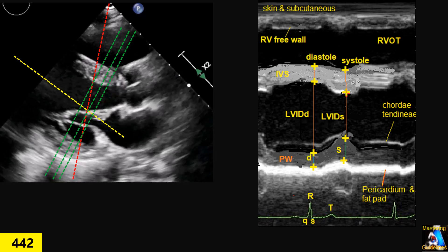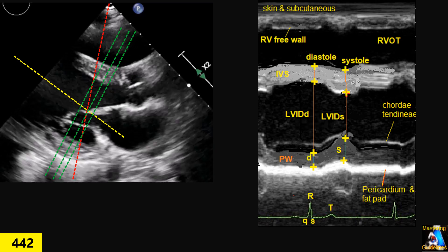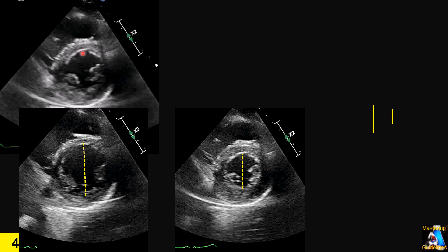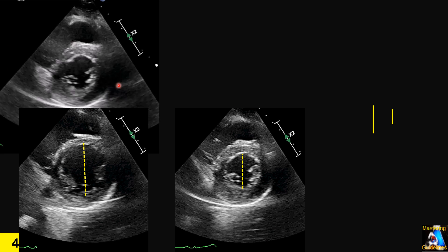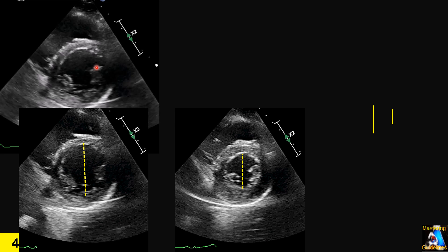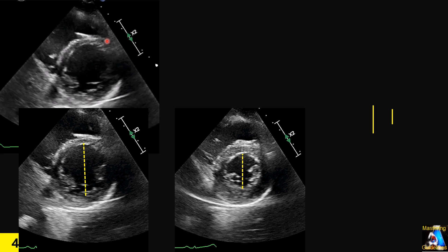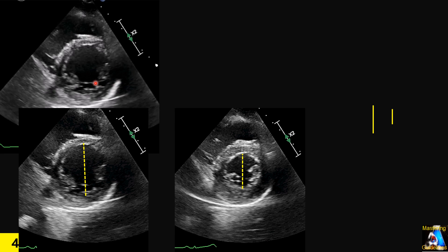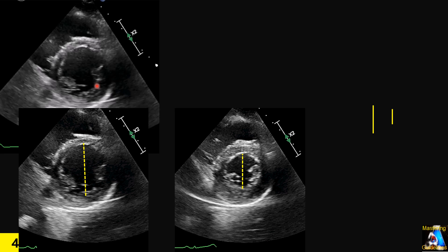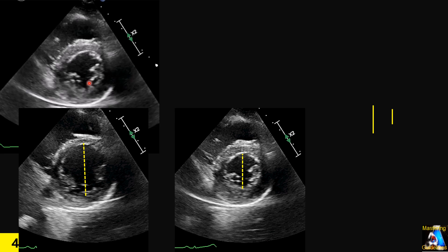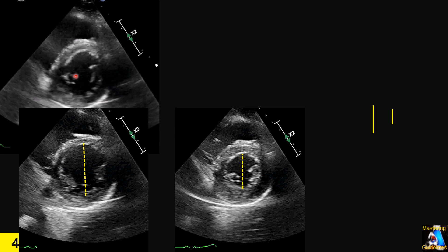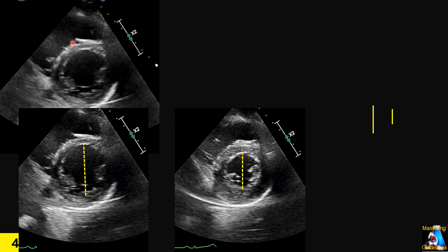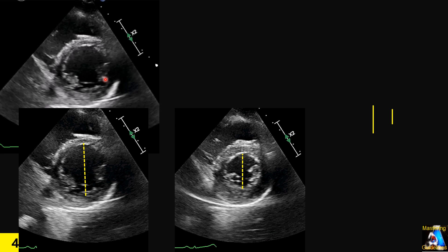We can perform these techniques — M-mode or 2D — on the parasternal short axis (PSAX), which is actually more accurate and reliable. When we have a good window, strong endocardial visualization, and correct imaging at the short axis showing a circular shape — and the three conditions are met: no wall motion abnormality, no arrhythmia, no asymmetrical hypertrophy — we go to the view between the tip of the mitral valve and the papillary muscles. That circular cross-section is the best way to measure ejection fraction.